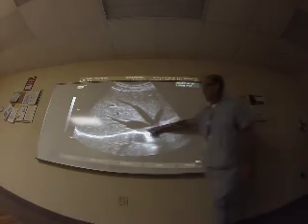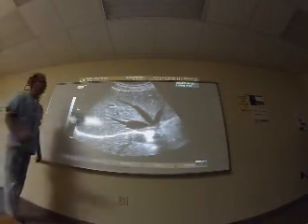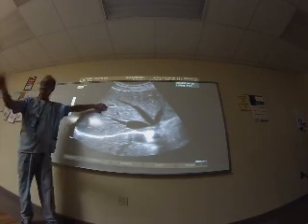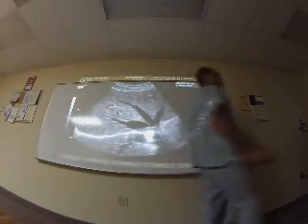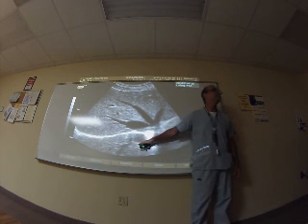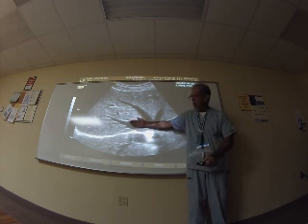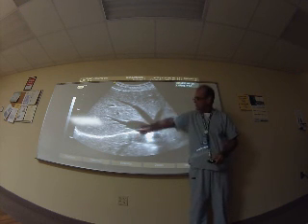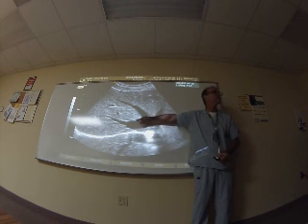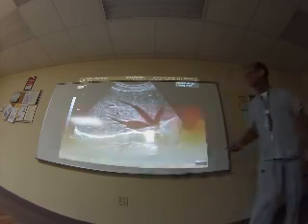In this picture, what is this hyperechoic structure that is here? The diaphragm. And what is the name of all this stuff here? Liver parenchyma. This is the structure of the liver. And you can see here, you know what it is? This is an artifact. This is not real. The diaphragm produces a mirror image of the things that are here. This is not real. This is an artifact because the diaphragm produces a mirror artifact.